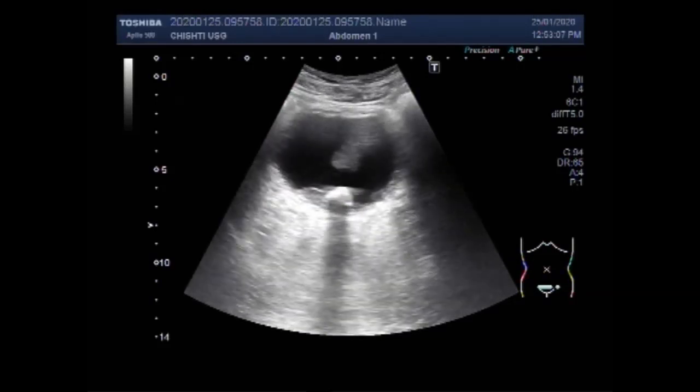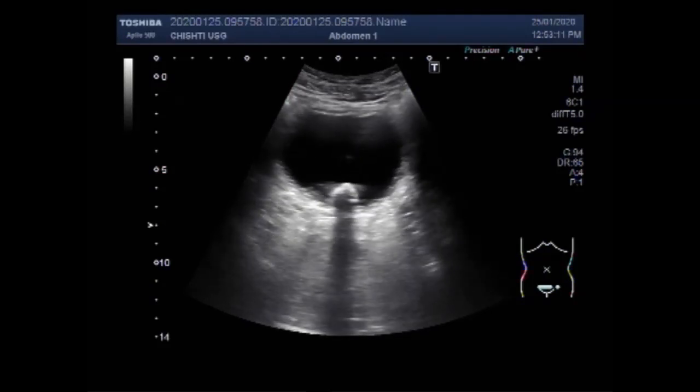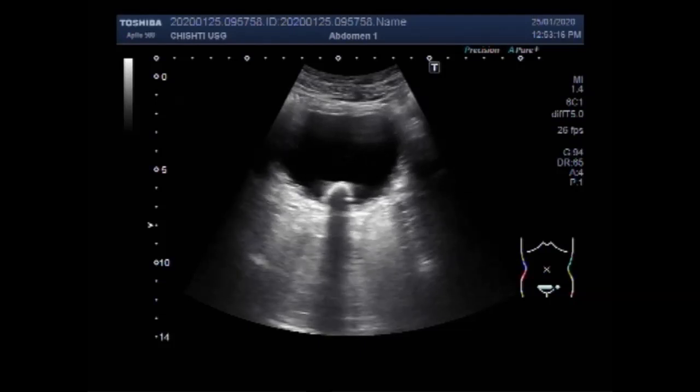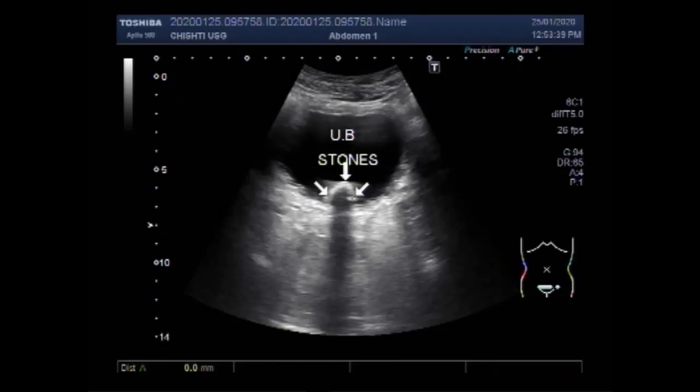Now you can see multiple stones lying in the base of the urinary bladder. These stones are obscured by the enlarged prostate, and you can see them by outer probe handling, looking behind the enlarged prostate to view the lower portion of the urinary bladder.